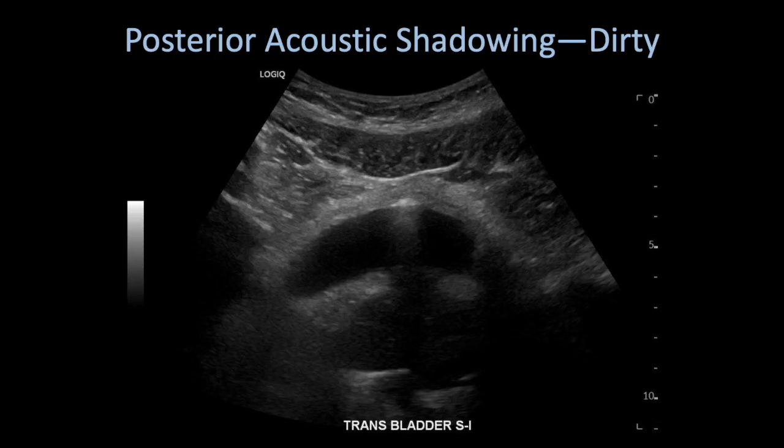Going back to our example here, you can see the echogenic structure within the bladder, which represents air, that you're getting reflection off of. You're getting absorption as well, which is causing the posterior acoustic shadowing, but you're also getting reflection from fascial planes, and that's leading to the dirty acoustic shadowing that you can see here.